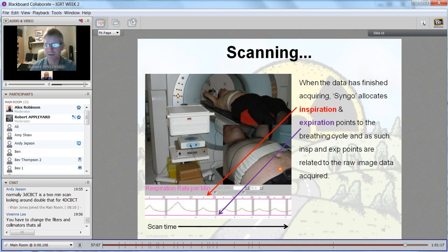But having said that, I think people often forget how significant the dose is from CT, and particularly cone-beam CT. From a diagnostic perspective, I'd rather spend a day having a look round Chernobyl than having a whole body CT.